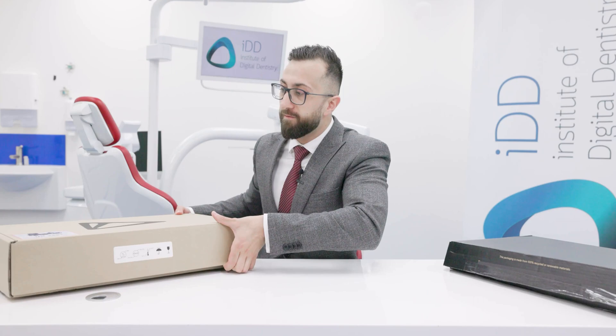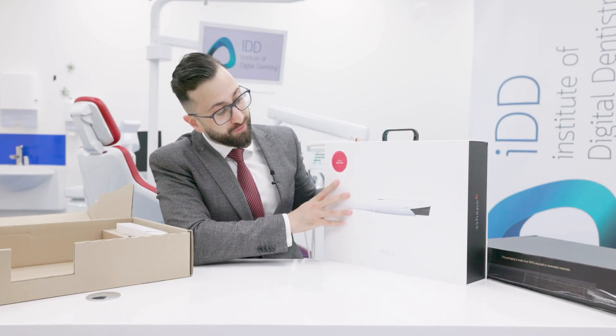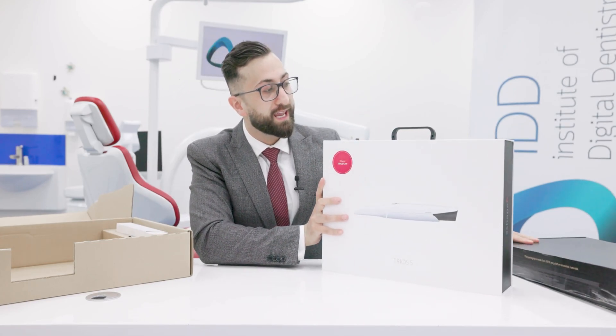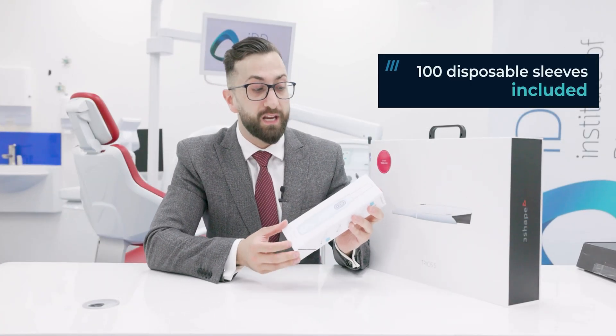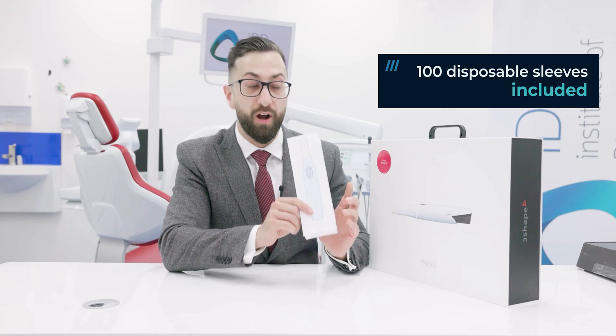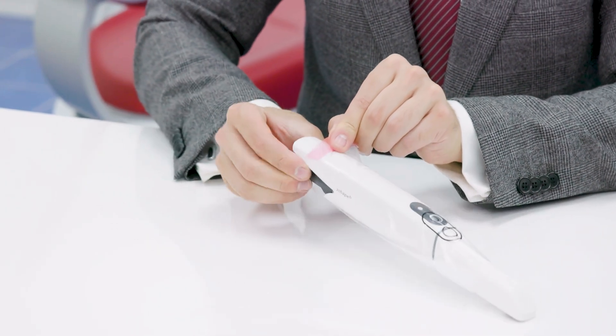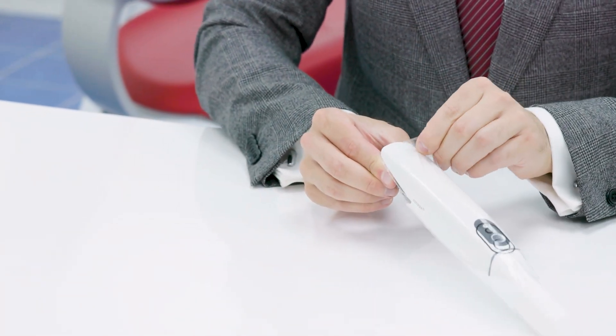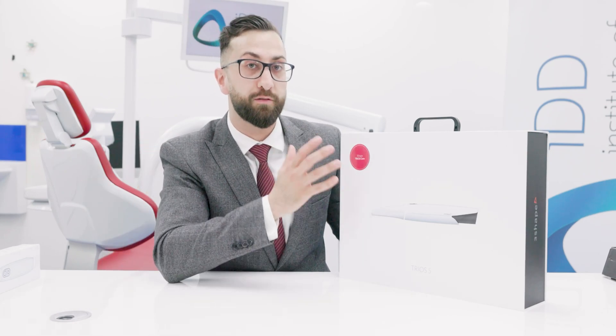Let's open the Trios 5 box — here it is in all its glory, with really nice presentation by 3Shape. With the Trios 5, the company includes 100 barrier sleeves that you can slide over the scanner, in a push towards hygiene, especially in this post-pandemic world. On the box it says '3Shape Trios Care.' With every 3Shape scanner this is included, and once it runs out, you can stop the subscription and go to Trios Only, making this a subscription-free scanner.